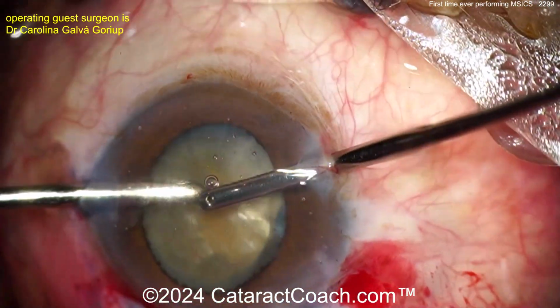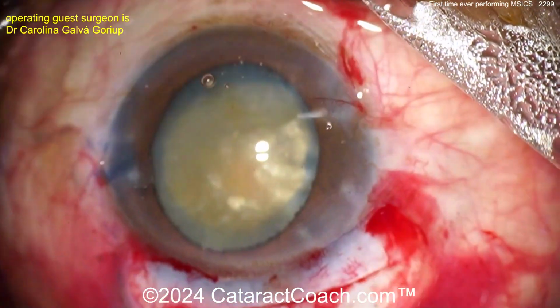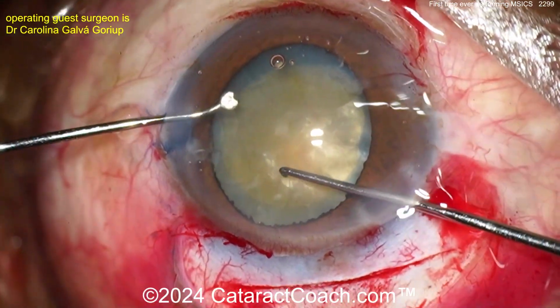That's reasonable. That's very reasonable. There, I can see the dense part of the nucleus. There's that yellowish kind of endonucleus. More viscoelastic going inside the eye. And now let's get this thing out of the bag.